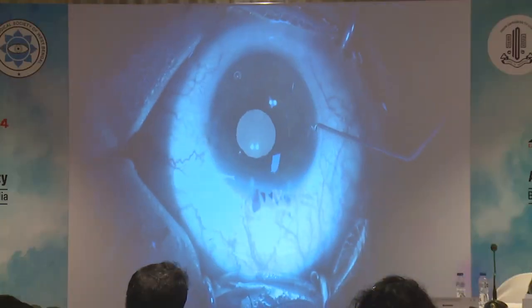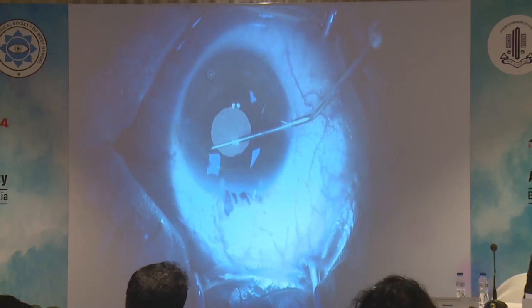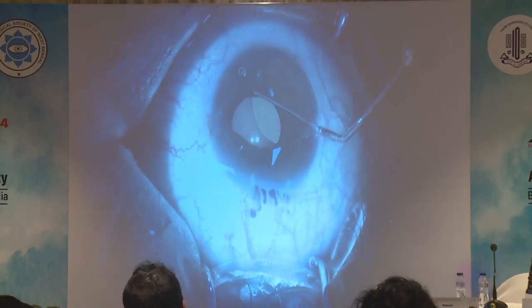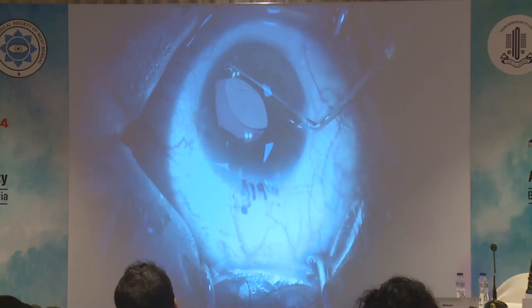Put viscoelastic. Then I dial the 3-piece IOL into the sulcus.